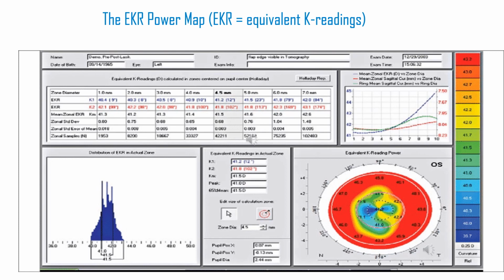So it is like asking what your anterior corneal value is based on the historical corneal index. But you have already accounted for the anterior and posterior corneal ratio with the true corneal index in the first step, and then back-calculated it to the anterior corneal values with the historical corneal index, which is 1.3375.